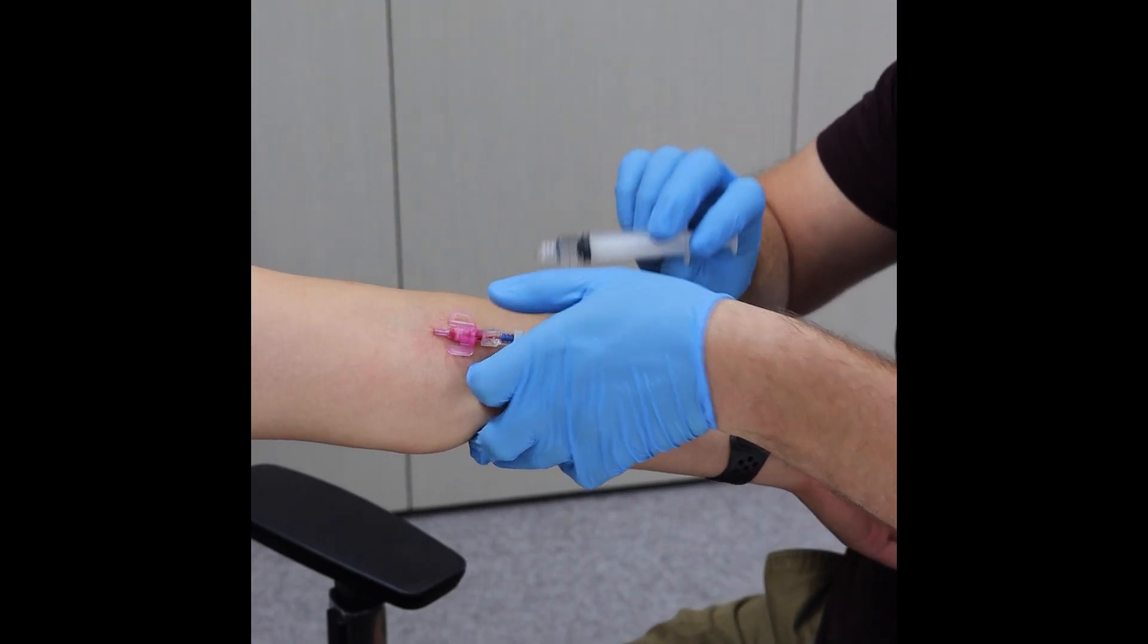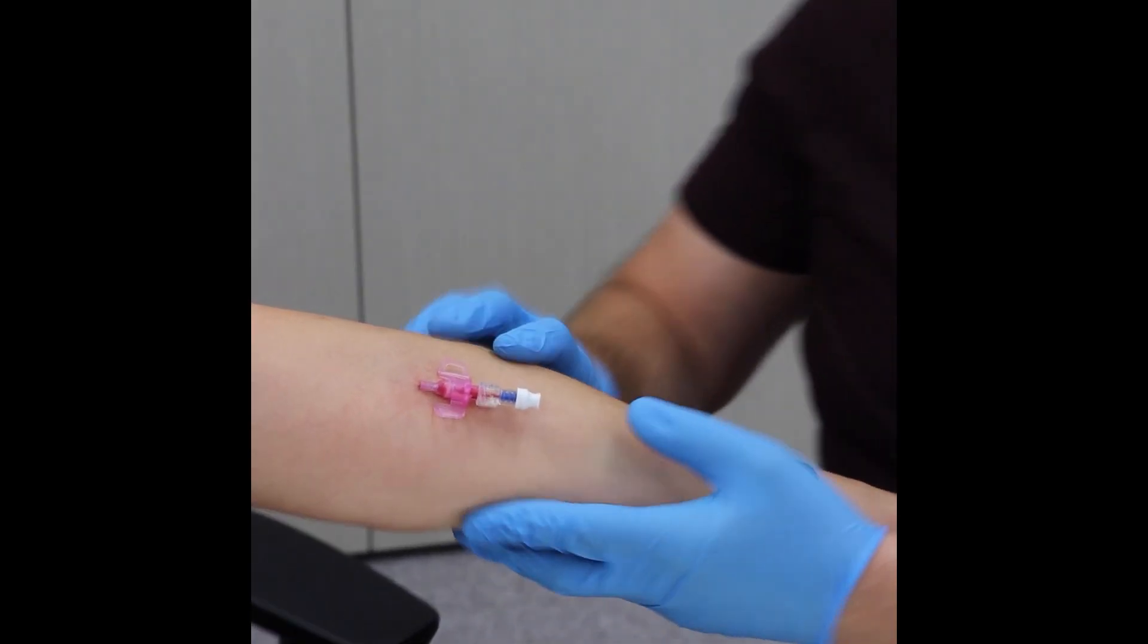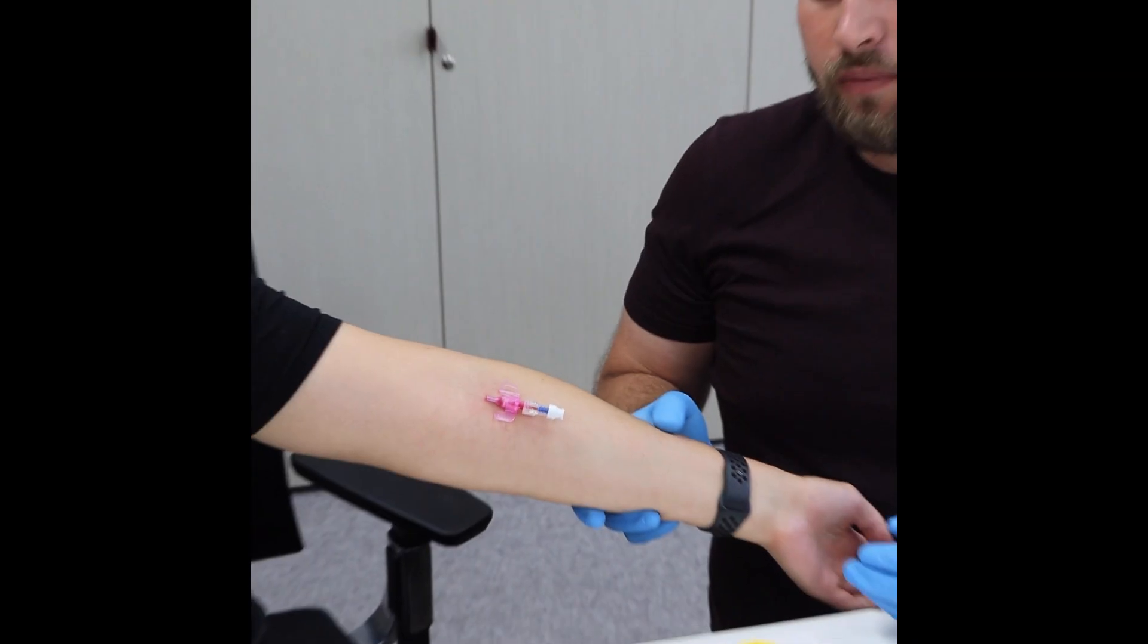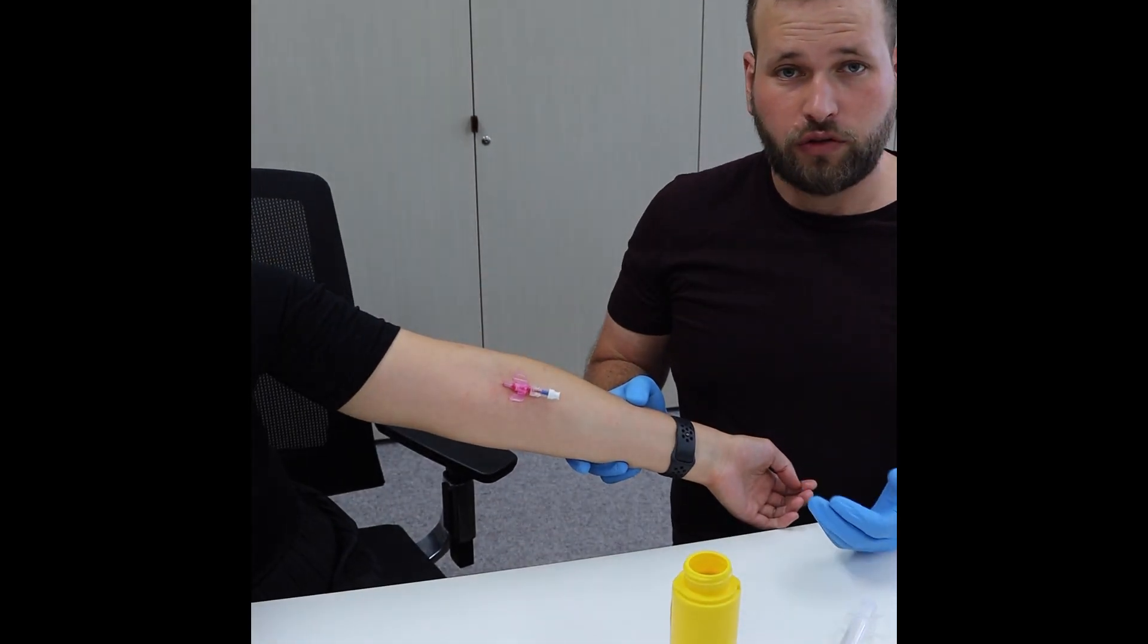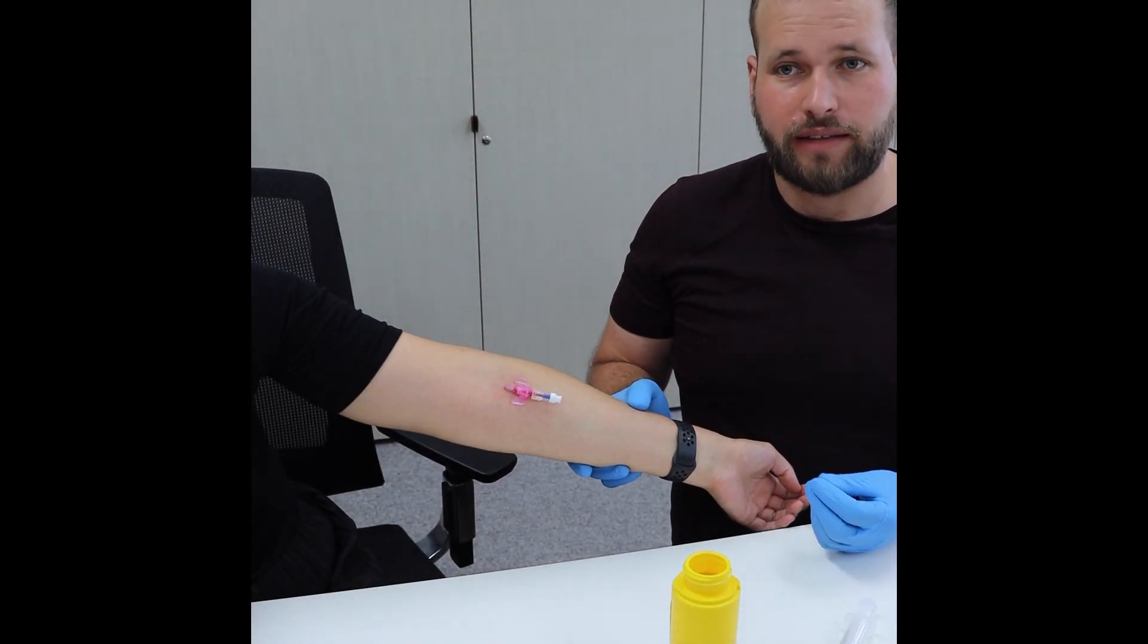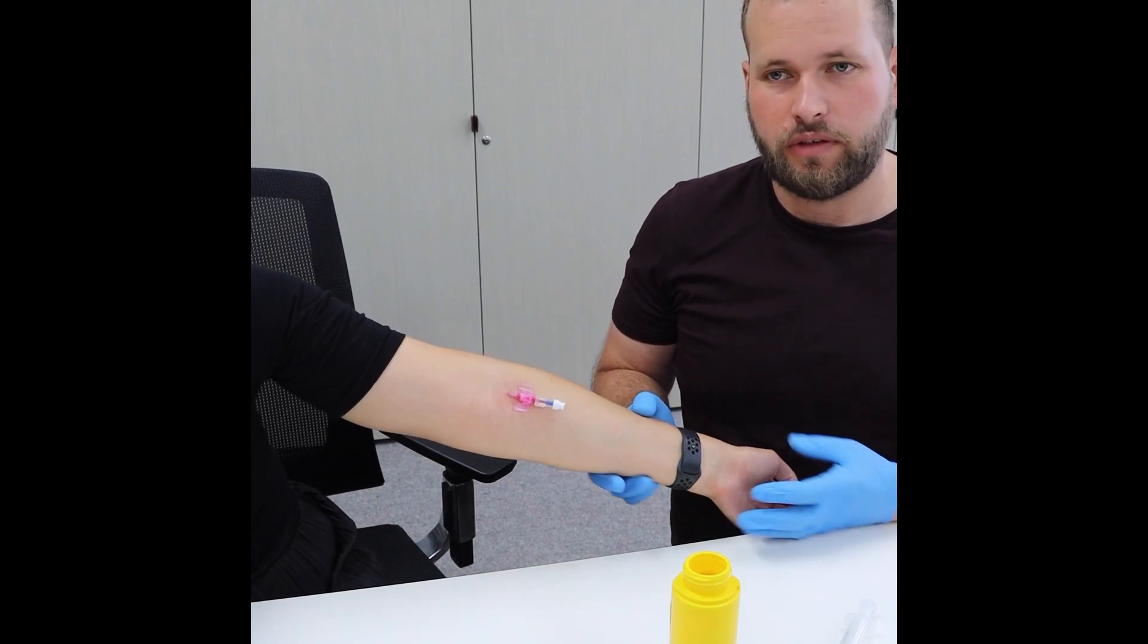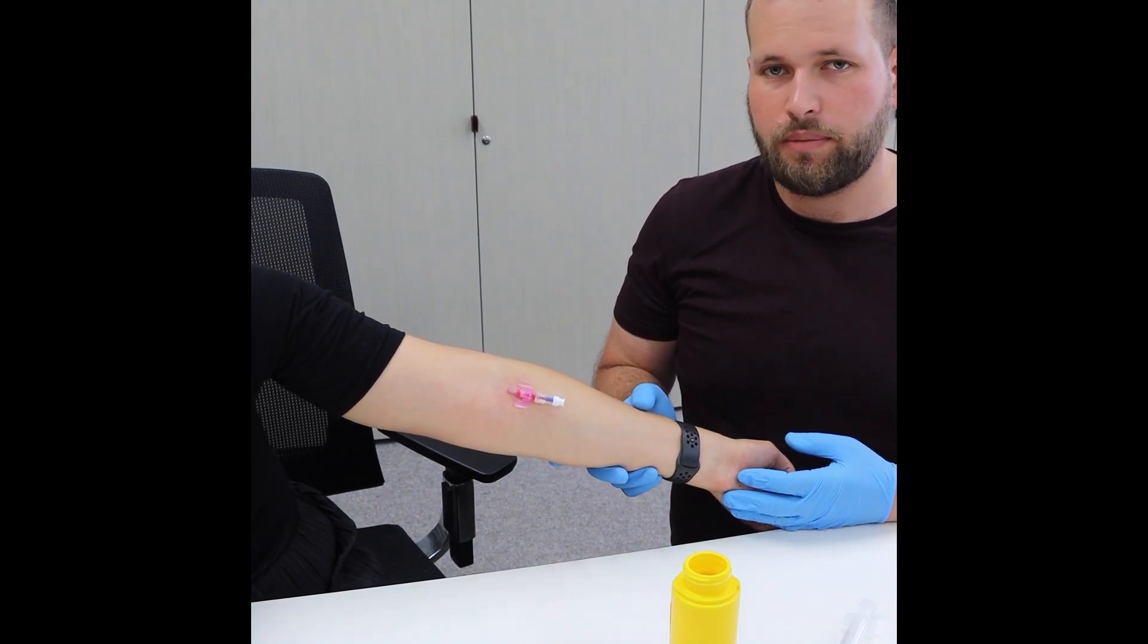I can just take this off, secure this as required and deliver whatever it is that I need to deliver. Little trick, when I was taught that, it's allowed me to save many cannulas. And I hope this is going to assist people out there.